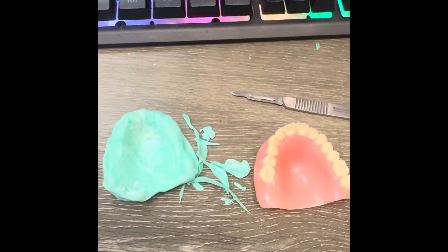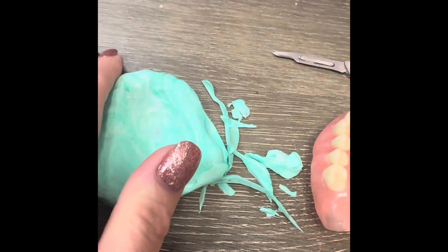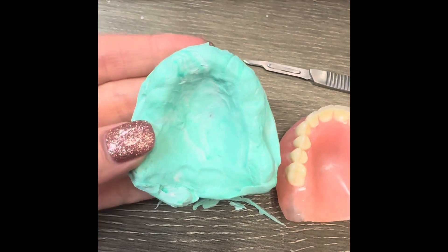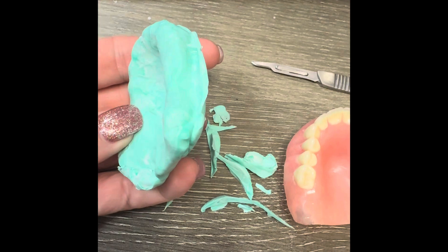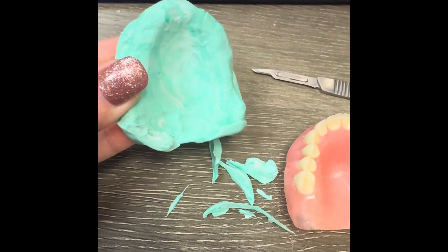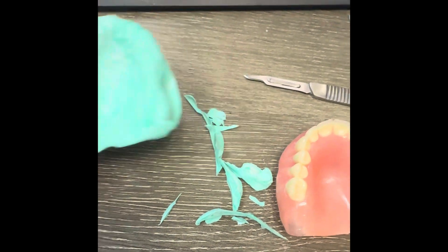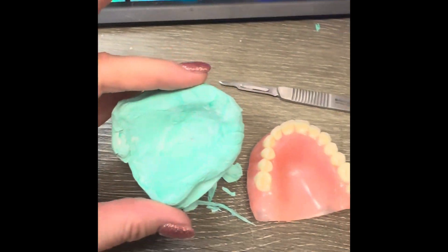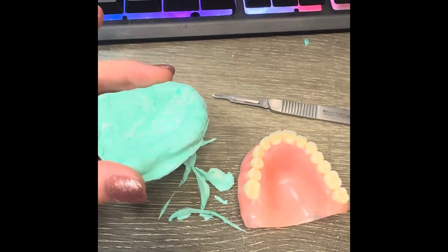Okay, so my quick part two to this video. I just trimmed kind of the flash off of here. This is what that interior impression looks like. I used a scalpel because I use a scalpel even for my arts and crafts, but you could probably do it with scissors.